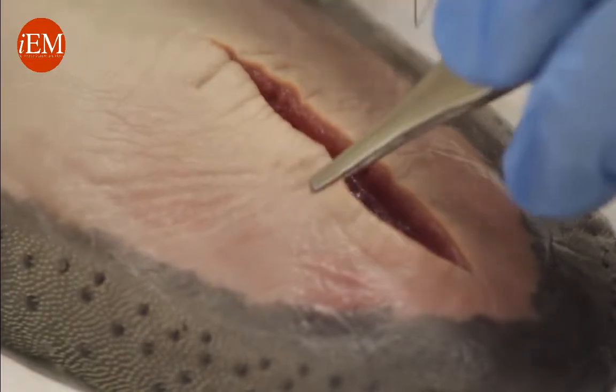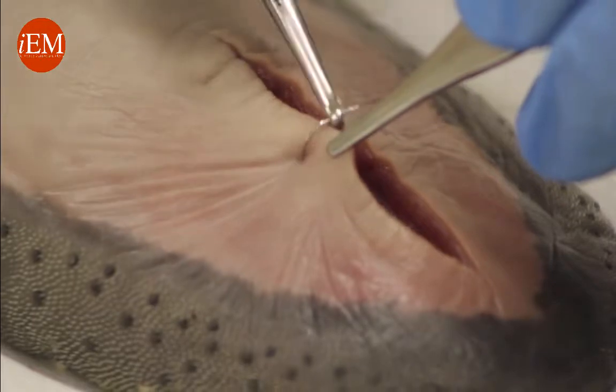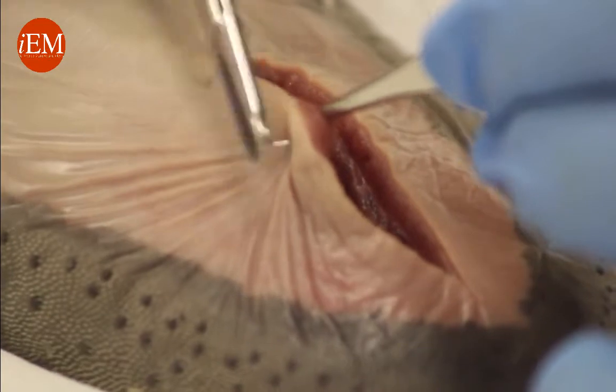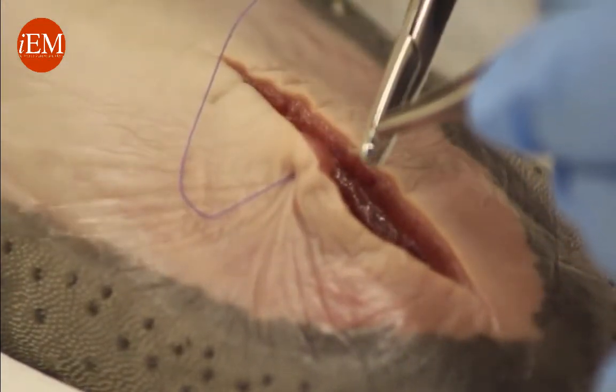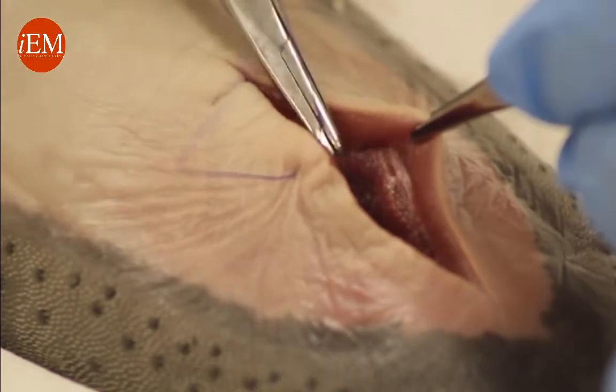We hold it and take the needle perpendicular to the skin, because you want to grab more at the base than on top. You come through the wound, grab with the forceps, and go on the other side — again grabbing more at the base than on top.